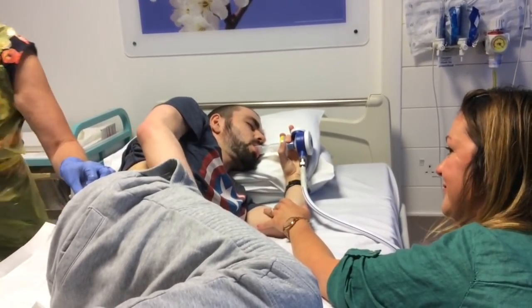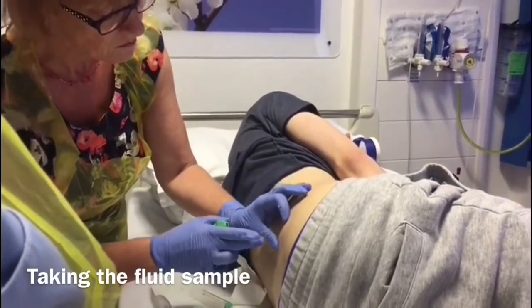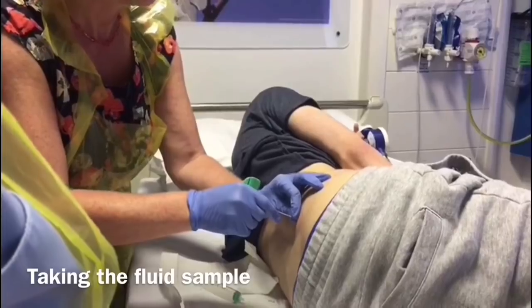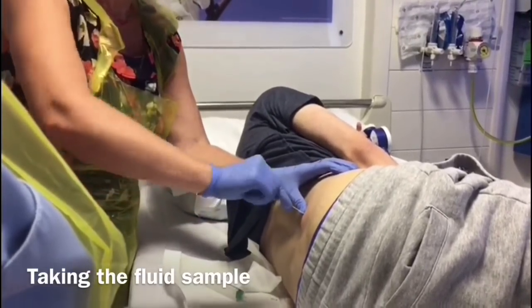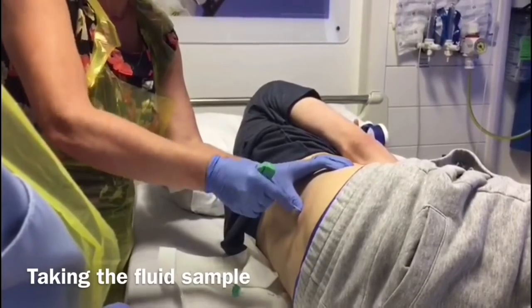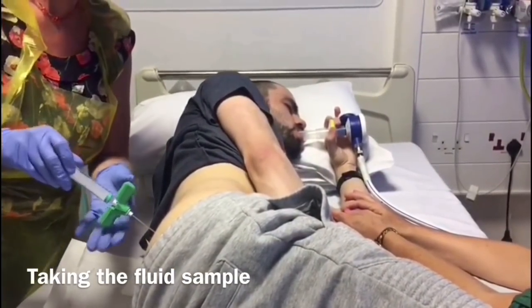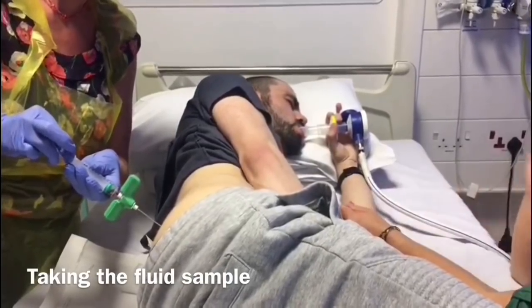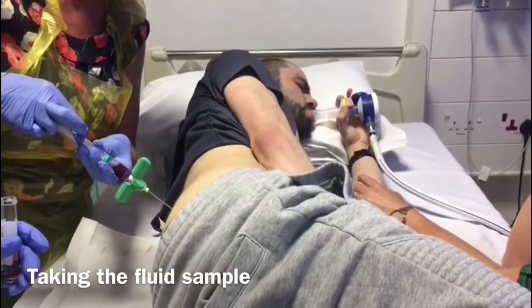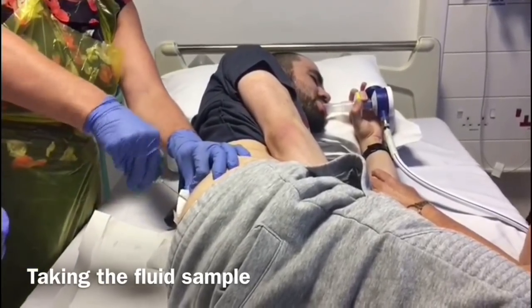Here we go. So you might feel something funny now — three, two, one. Well done, good boy Ted. It does hurt a bit more sometimes afterwards because you've got more cells. After your leukaemia treatment it's a bit watery, but now it should be nice and healthy — a bit thicker, so it's a bit more uncomfortable. The needle's out. I think I'm just enjoying the anaesthetic. You just keep going like that, you're doing great.